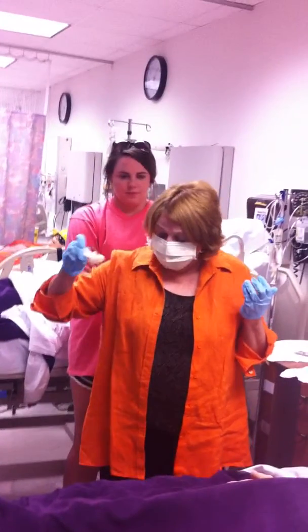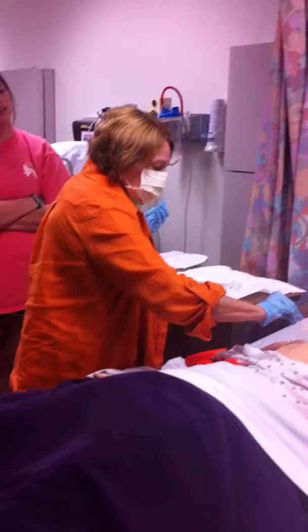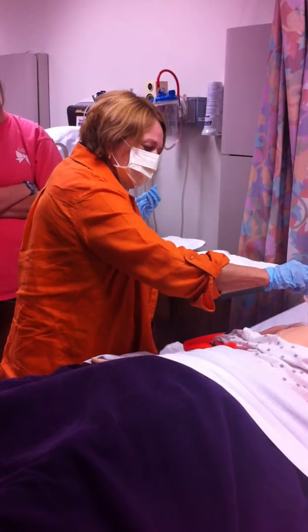So you don't have to go underneath the tubes? Well, this piece of tape is not really going to be there. That's just holding this line in. So you would be cleaning all around that site. Because that tape is there, it makes it a little hard.